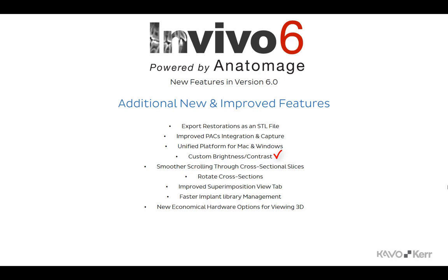Invivo 6 is based on a new multi-platform code to offer more consistent Mac and Windows versions. The software allows for the adjustment of the brightness and contrast of each viewing window in the Section View tab. Invivo now offers smoother scrolling through the cross-sectional slices. A new toolbar function has been added to the Arch View tab that will allow for the rotation of the cross-sectional slices.